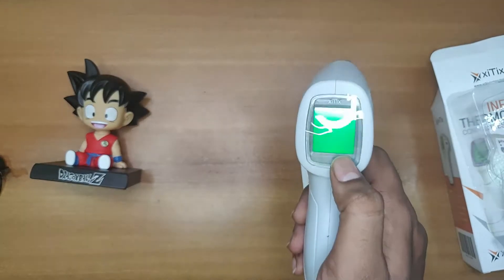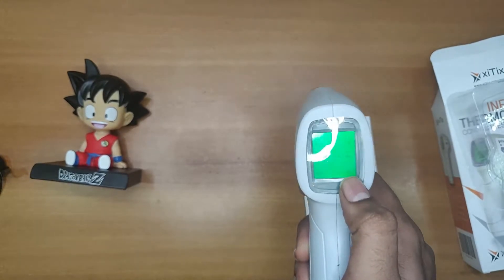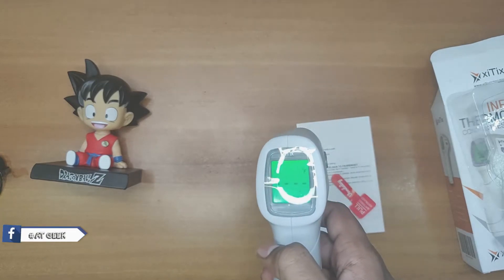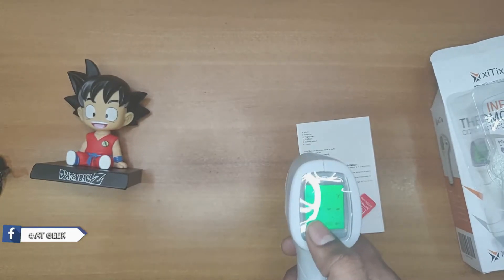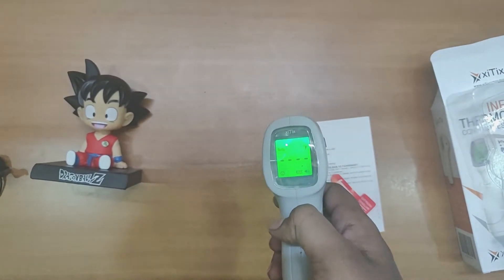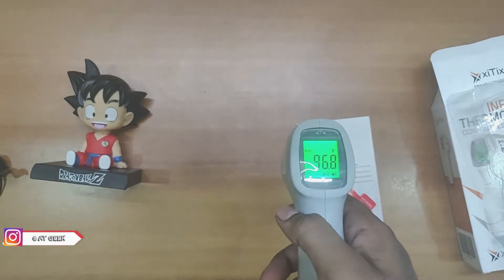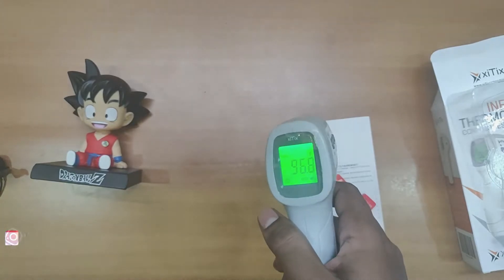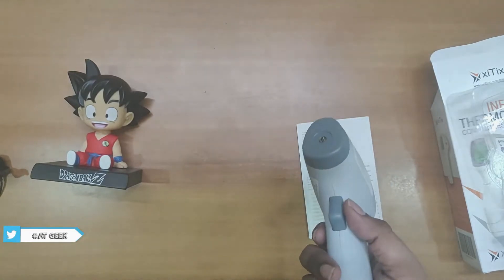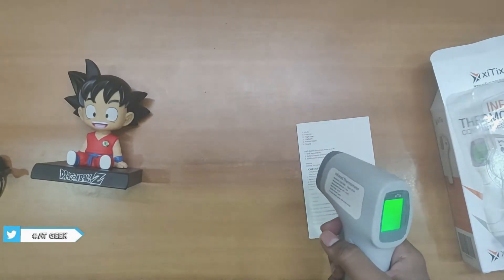Here we got a pre-applied screen protector. As you can see, it shows a battery percentage and also a sound indicator. The device is showing 96.8 as the pre-temperature — the basic ambient temperature. Let me see how it works.